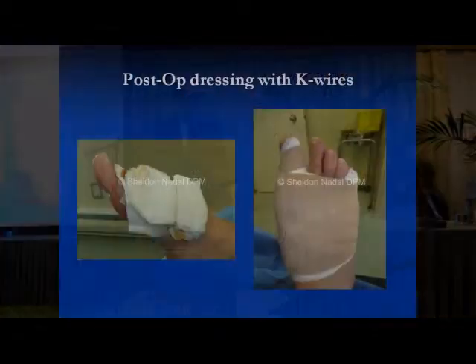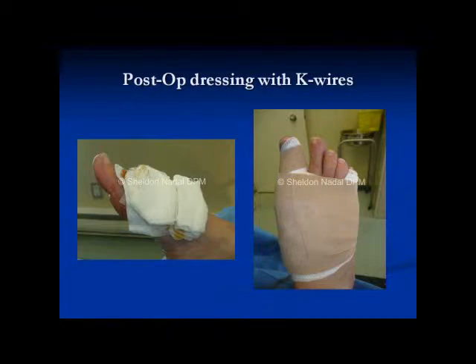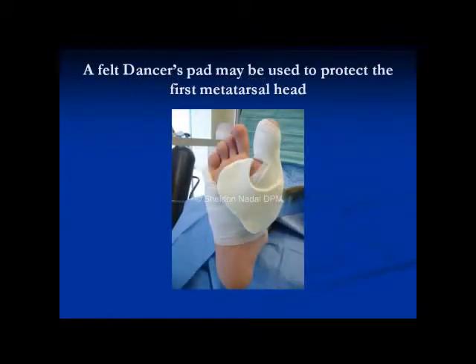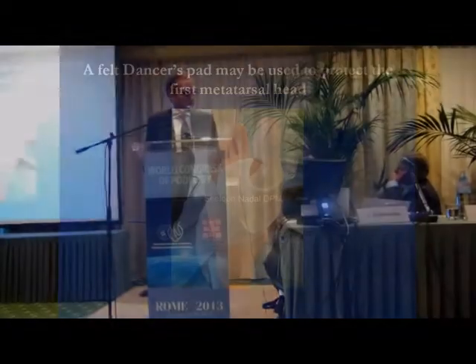If you are using K-wires, you want to put gauze padding distal and proximal to the K-wires to relieve pressure against the wires, because it will irritate the patient, so then you have a bulkier dressing. And if you're concerned about cracking the shelf, you can use a dancer's pad to reduce pressure from the ground reactive forces, so you're less likely to crack the dorsal cortex, especially with an older person.